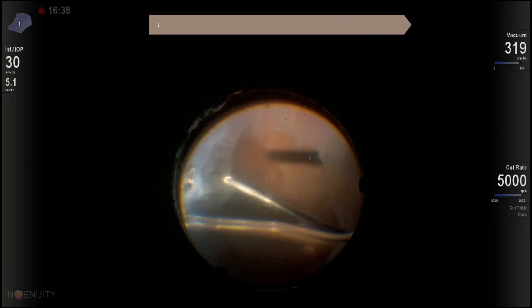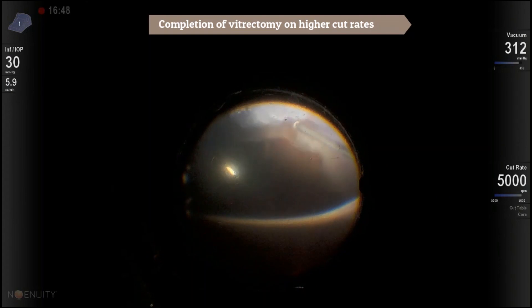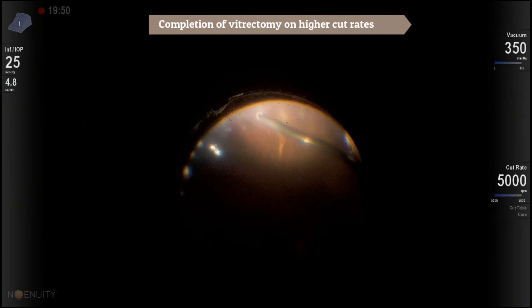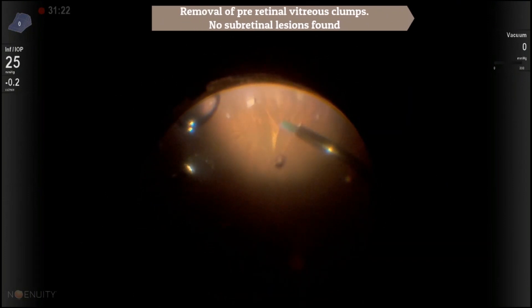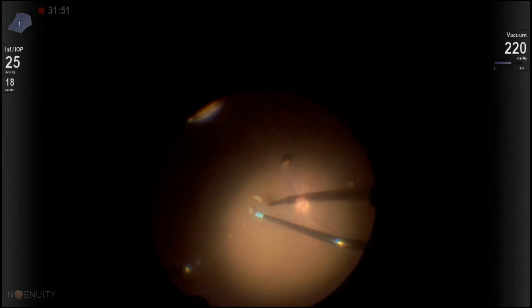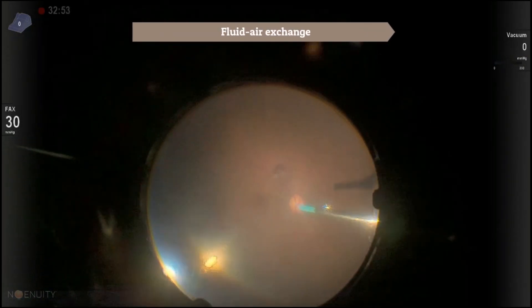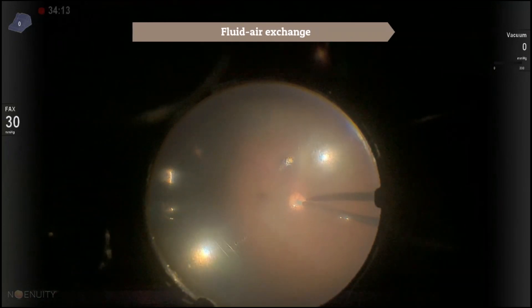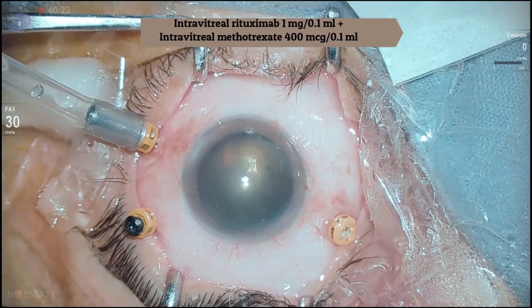The vitrectomy was then completed using a higher cut rate. Pre-retinal vitreous blood clumps were removed with a flute needle. Underlying retina did not reveal any sub-retinal lesions. Fluid-air exchange was done, and intravitreal rituximab as well as methotrexate were injected through the sclerotomy.